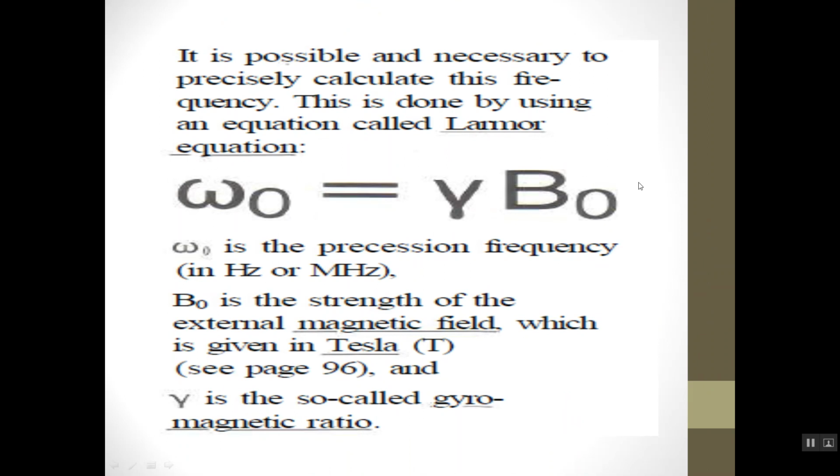according to the external magnetic field, because the gyromagnetic ratio is constant, specific for each atom. Now if I know which type of machine, 1.5 Tesla or 1 Tesla or 0.5 Tesla, it's also easy to know the Larmor frequency or the precession frequency of protons. So it's easy to create a radio frequency pulse coming from the coil to excite the protons with a frequency equal to the Larmor frequency of protons.